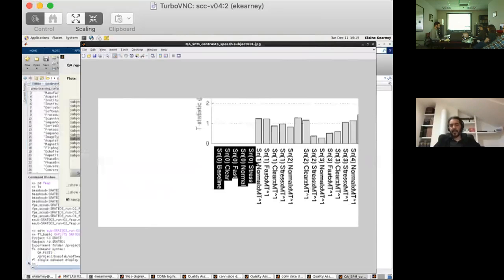Well, the invariance across sessions is two-sided. So invariance about session has to do with, for a covariate, for example, for an interaction, basically telling you whether the association between functional activation and what was it? This was not response time. This was duration, like a production duration. Yeah, like speaking time.